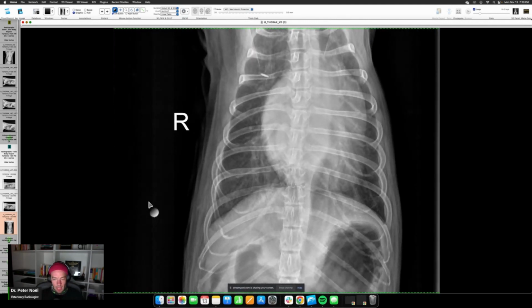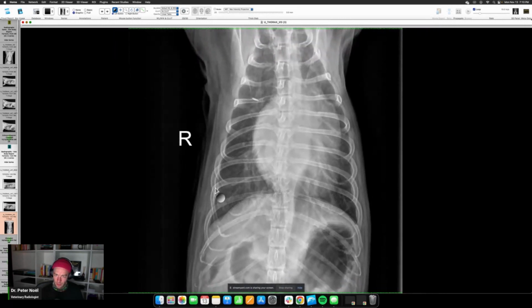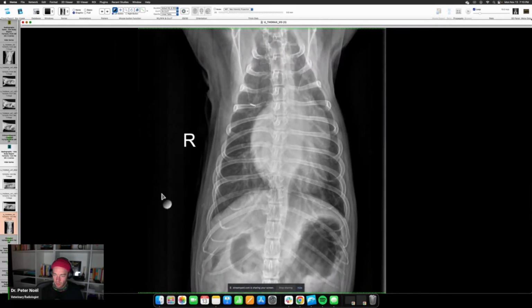This one? And I would caution you with zooming in too far, too often, and not because I look at these all day and I don't need to, but you'll start to hallucinate and you'll see stuff, and then you'll lose the forest for the trees, and you'll kind of get overwhelmed and you'll start making up nodules and stuff. So the over zoom, you've got to be careful.